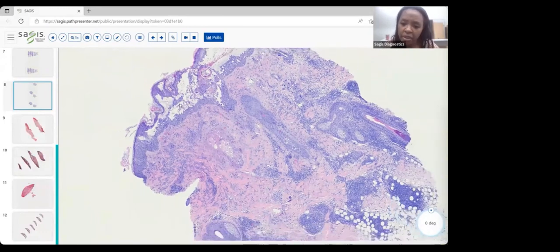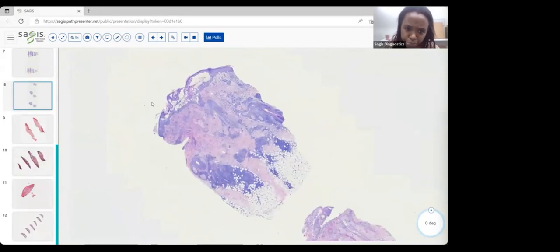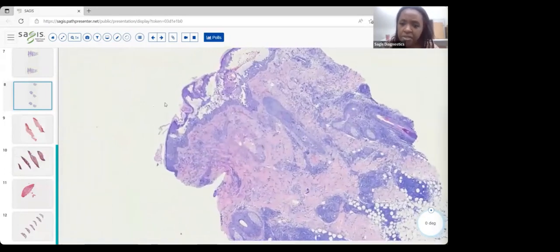And then with herpes zoster, some very interesting things can happen as the lesions are resolving or have a scar, essentially. Different reaction patterns have been seen in zoster scars. So you can certainly get a bit of a granulomatous reaction that's been identified. Granulomatous vasculitis has been characterized.